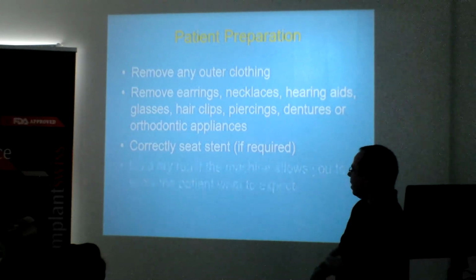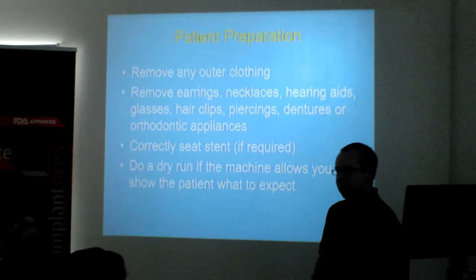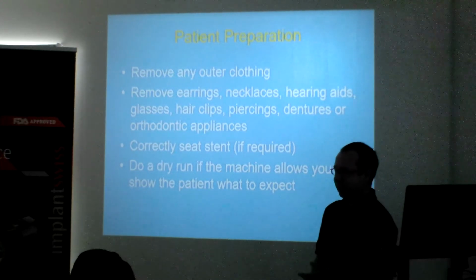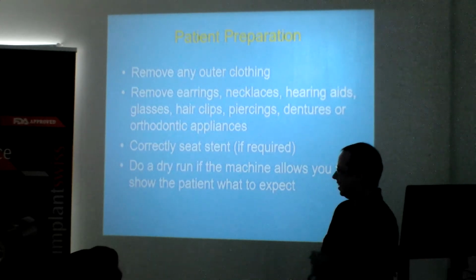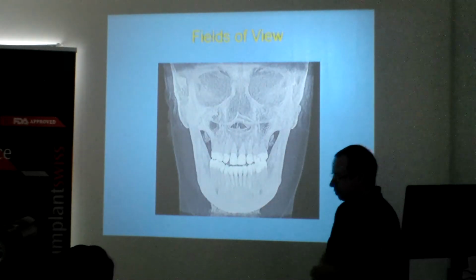Okay? And also, if the machine allows it, do a dry run as well. Show the patient what's going to happen. You've got an anxious patient, claustrophobic. We've even been known to put teddy bears into the scanners before now to show children what's going to happen. So there's nothing wrong with doing it. If it's functional on the machine, use it. It has its benefits.